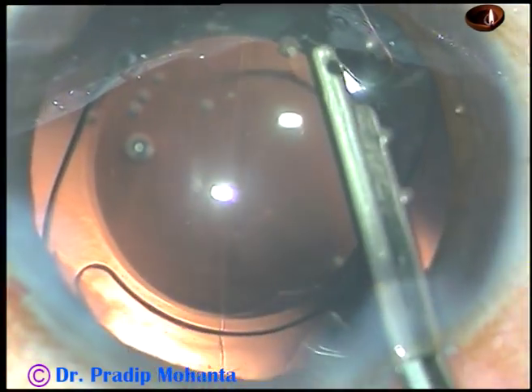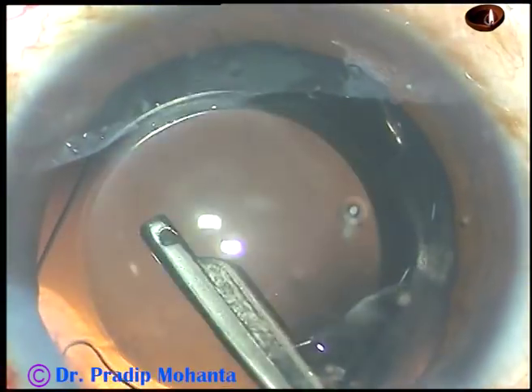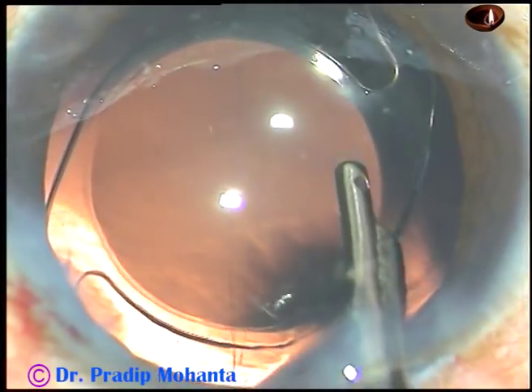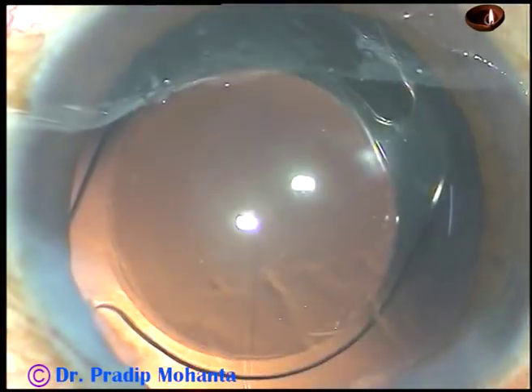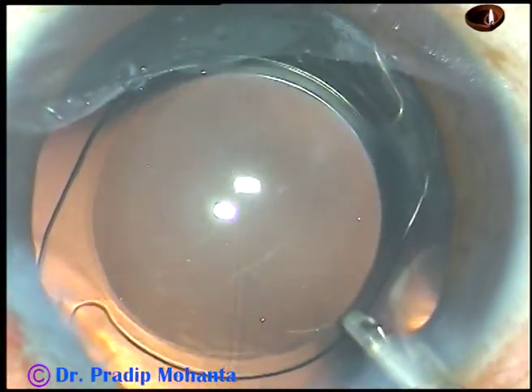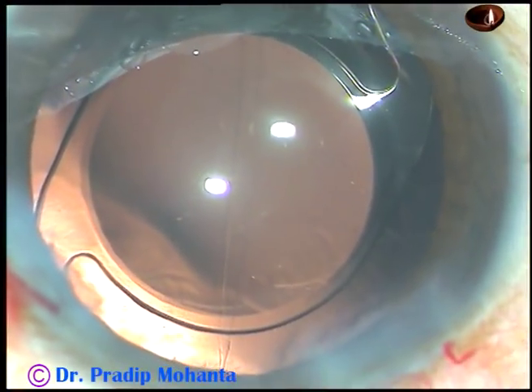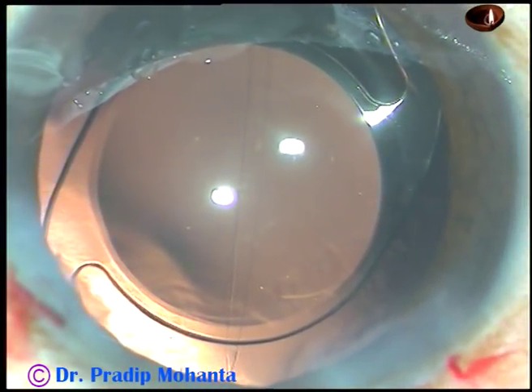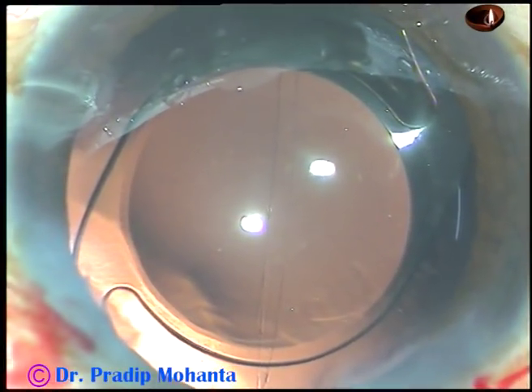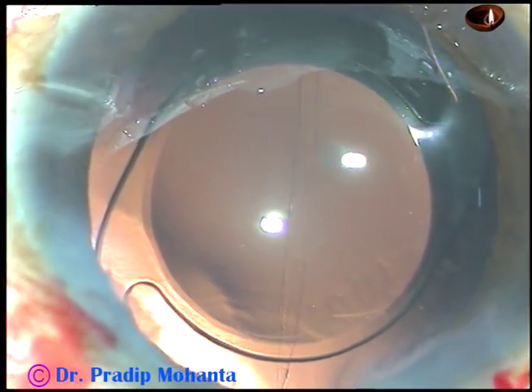And now this is the final lavage of the anterior chamber. See, there is a lot of visco sticking to the corneal endothelium. The fluid jet is sent towards the corneal endothelium by the aspirating port, flushing some BSS. Then the anterior chamber is nicely formed by BSS and the case is concluded.